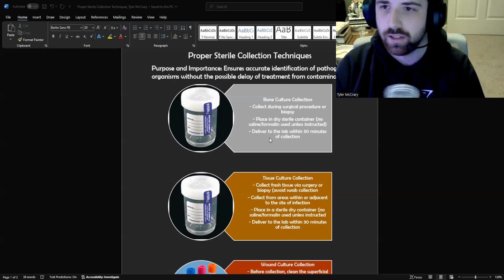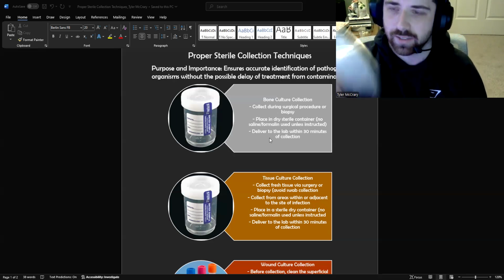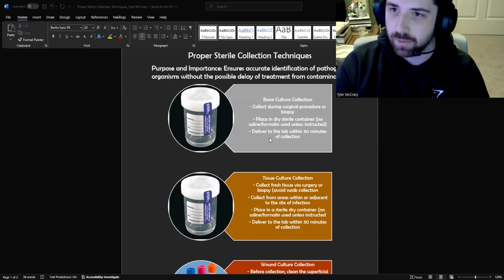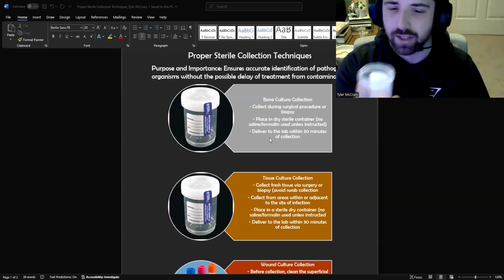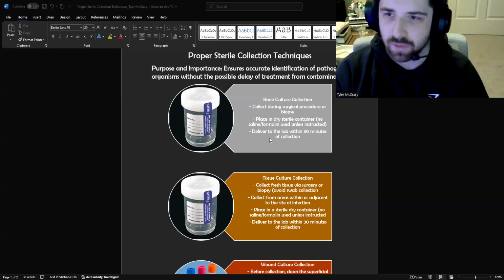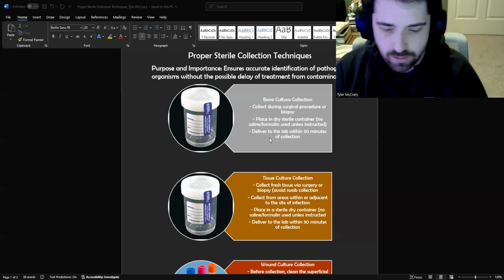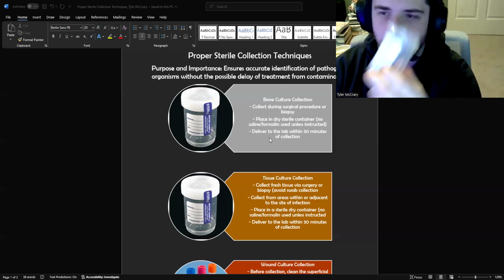Obviously, when you open the lid, you want to avoid touching the inside. If you were to open it and then pick it up and move it, you wouldn't want to grab it like this. You always want to keep your fingers on the outside to avoid contamination with any normal skin flora, like staph epi and stuff like that. So that is what you use for bone cultures.